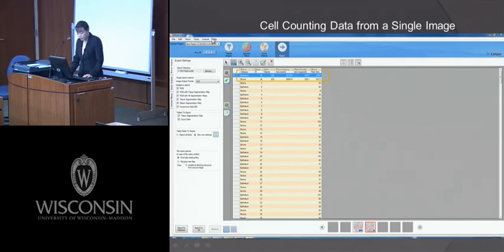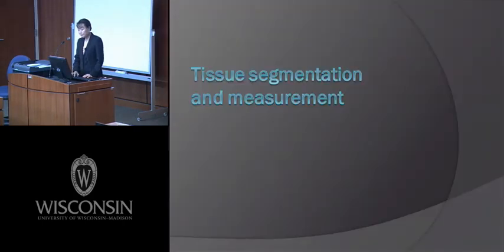And here it tells you that in the epithelial compartment, about 200 cells are positive for AR. This is just showing one image. If you want to analyze, say, 200 images, you have an Excel file to show the data. I'm just showing you one core's data, which can be done.